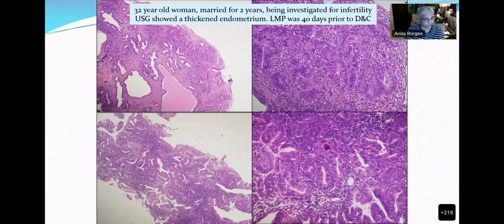Ma'am, the glands are like, we can see some outpouchings and branchings. Okay. Yes, I can see that. We waste time when we go there. I can see outpouchings and so on. Just tell me the answer to these 4 things. Right? Is there estrogen in the system?